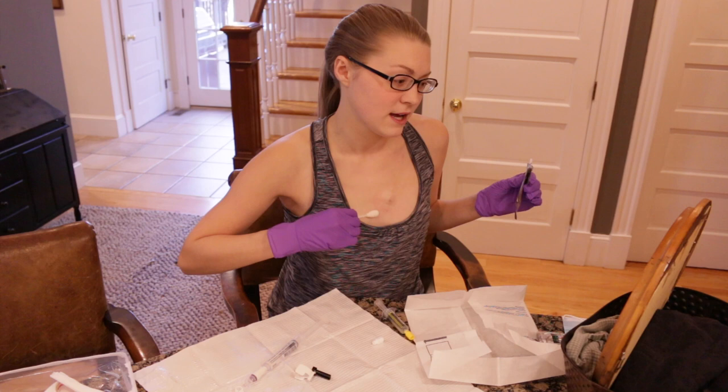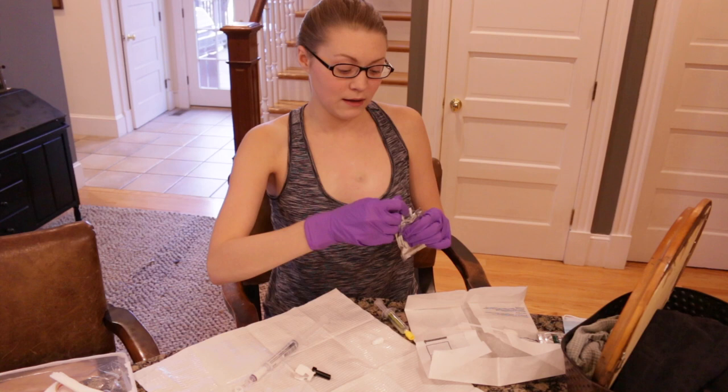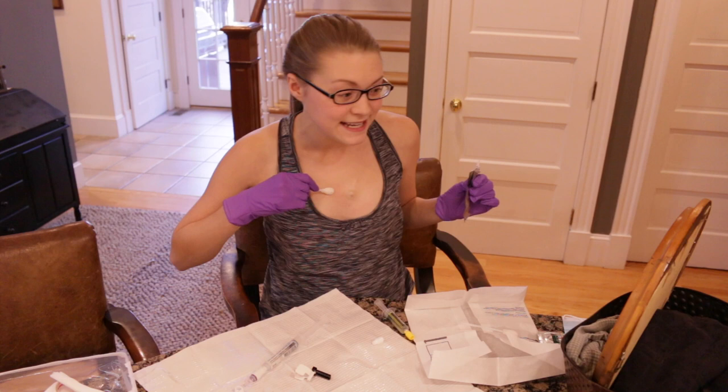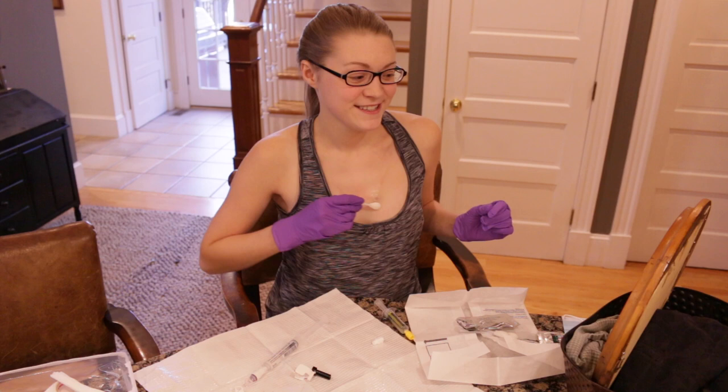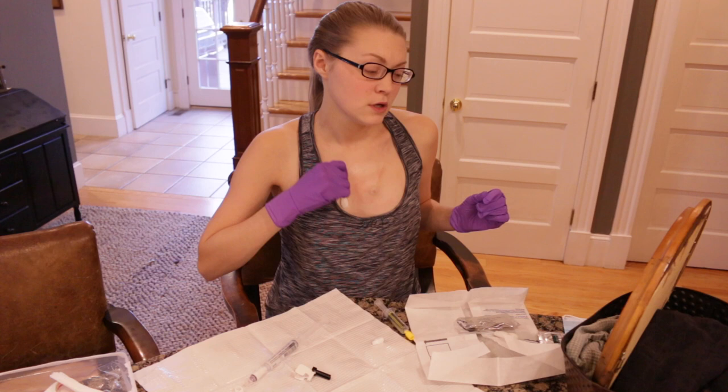This is probably the most important step. When I'm cleaning my port and the area, I need to clean every speck that is going to be under the dressing because the dressing will not stick properly. Now my port's pretty wiggly, as you can see — when I'm cleaning it, you'll just have to get to know what your port does. When I go to stick the needle in, I have to brace it really well or else it will wiggle and move. I've done my three chloroprep swabs and I'm ready for the next step.